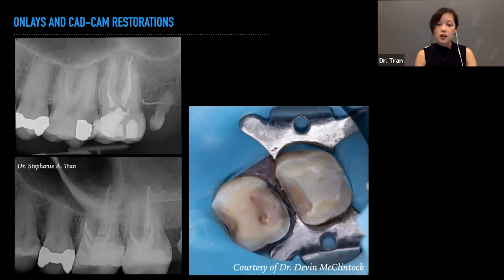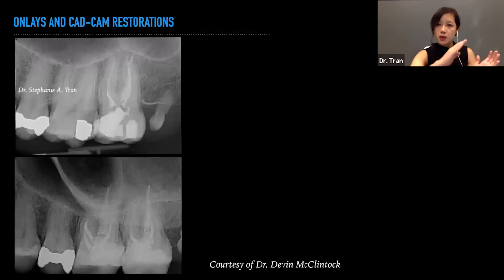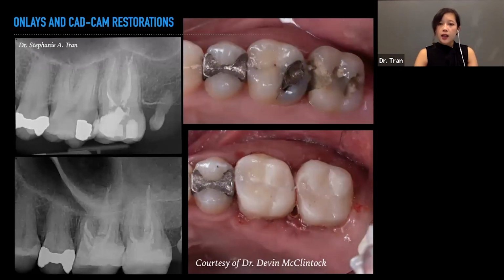So right after my endodontic treatment, we were able to restore the teeth right away, which is a great service and allowed us to maintain a lot of tooth structure. We can see here, when I did my endodontic treatment, I angled it, and then she was able to cement the crowns immediately after. We could see the before and after, thanks to the photos that she took.